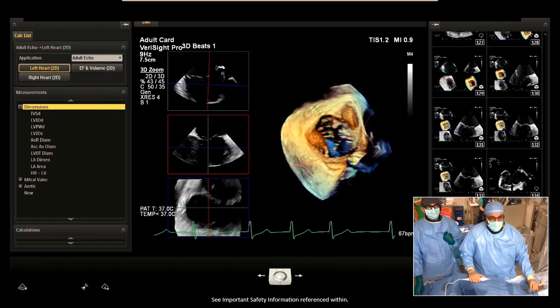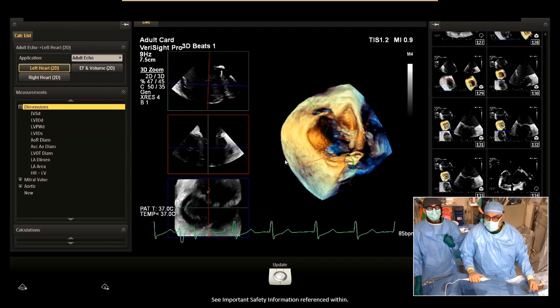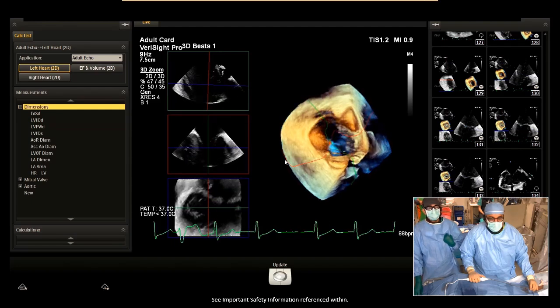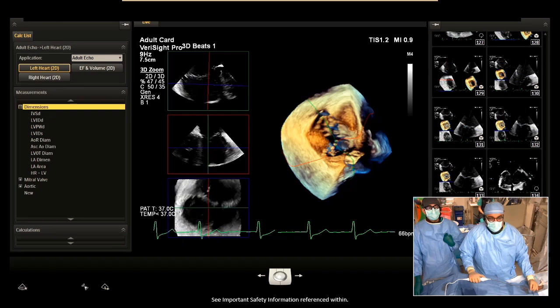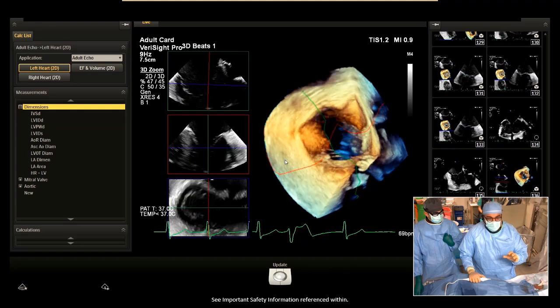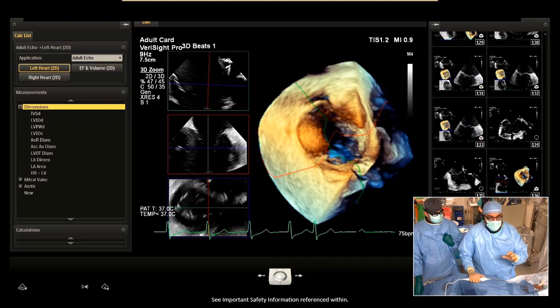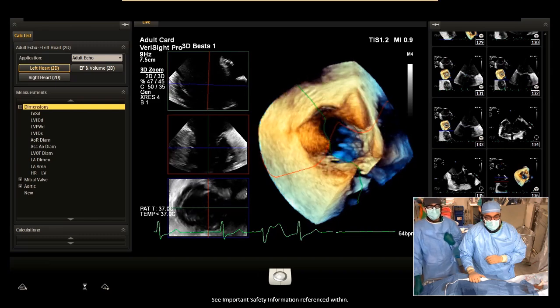Now I think what are your thoughts? Do you think the image needs to rotate a little counterclockwise on the screen, or we're pretty close? I think we're pretty close. You're pretty close. I agree with you on that. So basically what this tells me is that with a little bit of manipulation that I did, and without Edris having to adjust any of the planes, automatically what we're seeing is that our red plane now is situated over what our grasp is going to be.